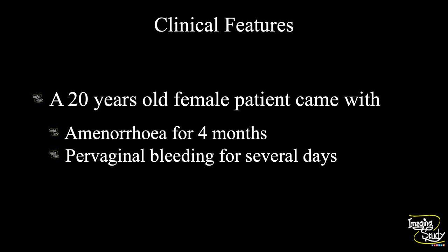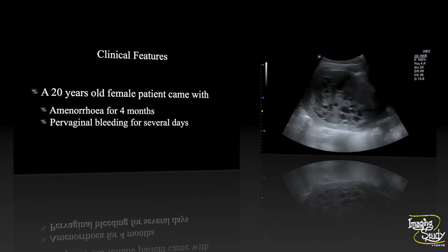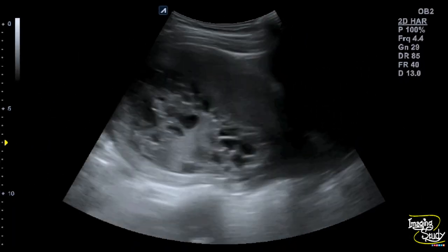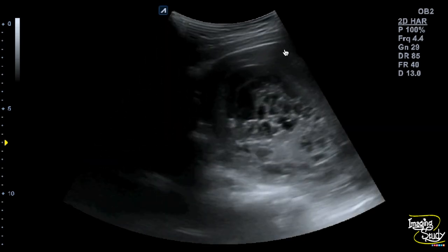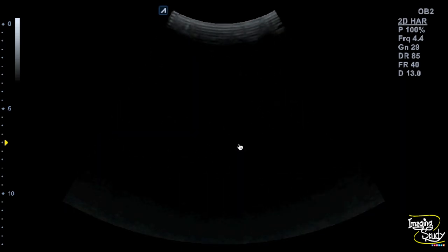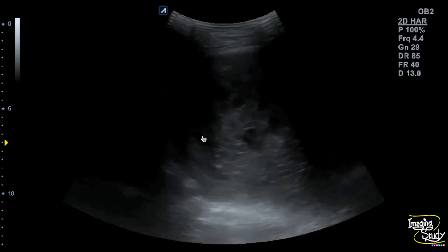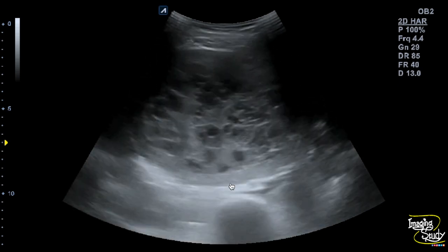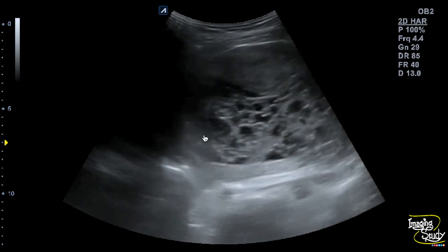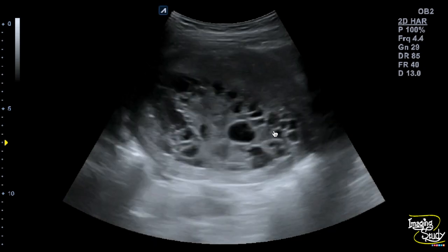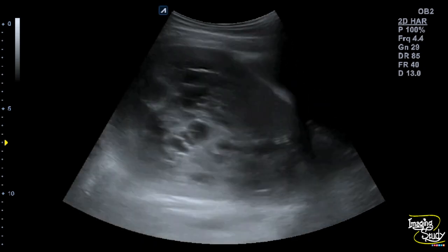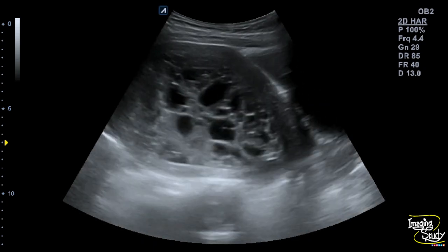Let's see what we have got on ultrasound. Here you can see the transverse and longitudinal section of the uterus. You can see a mass-like area within the uterine cavity with diffuse cystic appearance. This echogenic mass with numerous cystic spaces is forming the typical honeycomb or snowstorm appearance, which goes in favor of molar pregnancy.